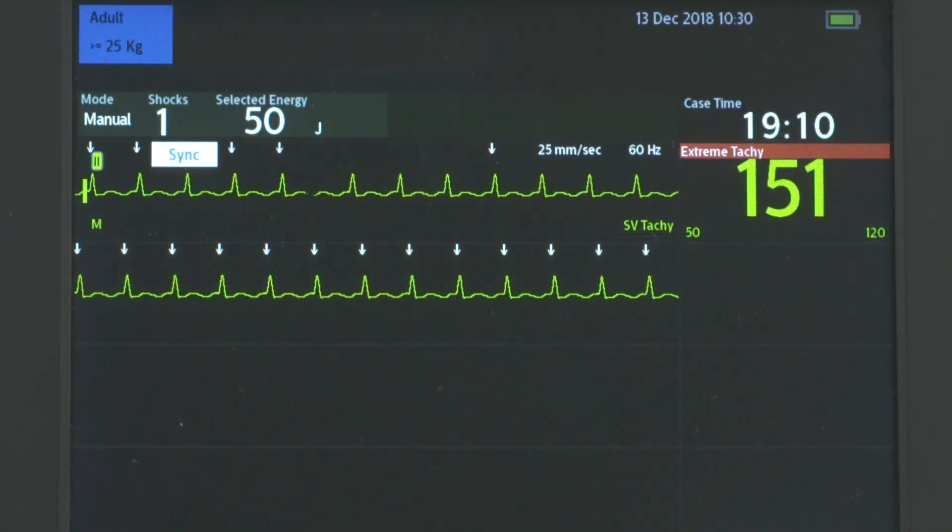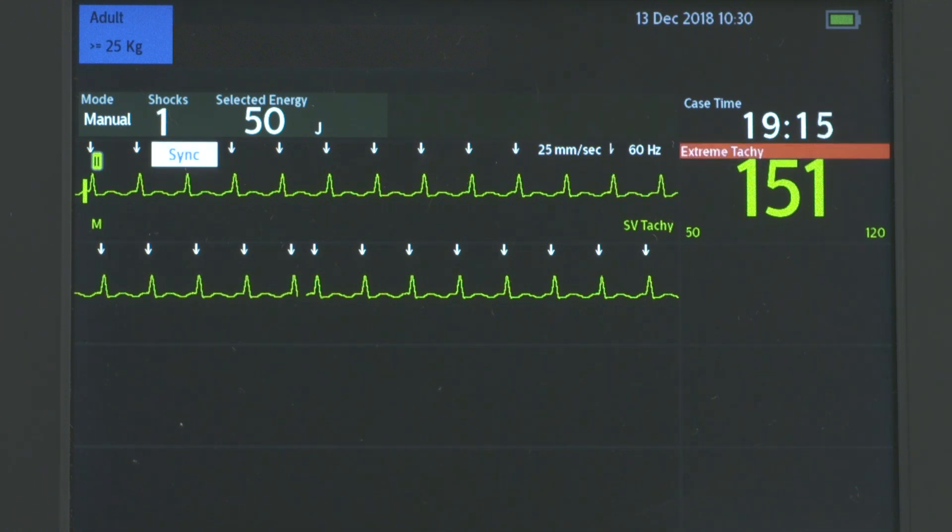Confirm the R-wave marker arrow appears only with each R-wave, signifying R-wave detection.